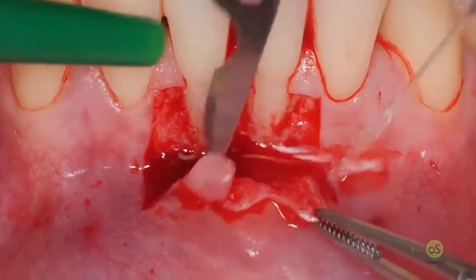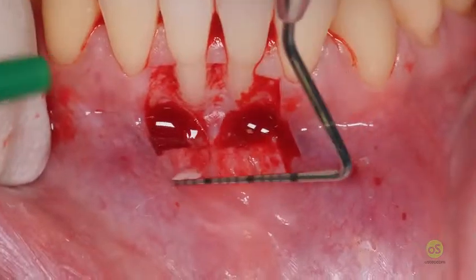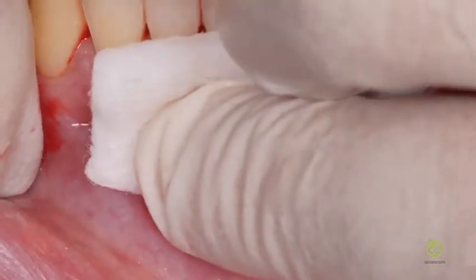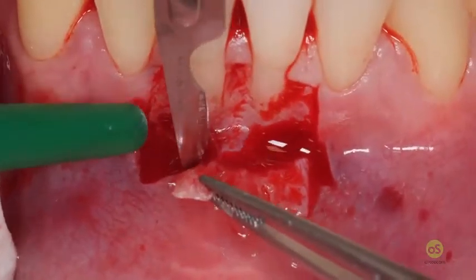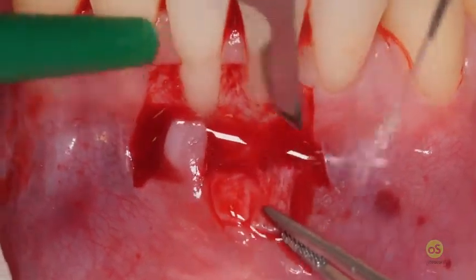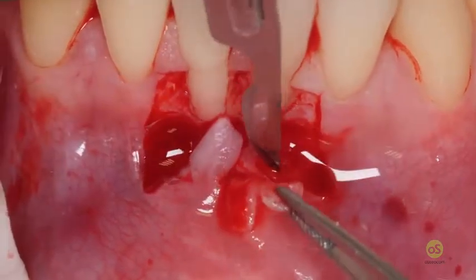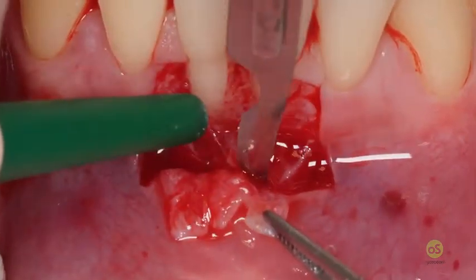Now you should see very well the muscles inserting perpendicular to the root. The flap is only made by 1, 2, 3 papilla. Now I have to create a flap by making this superficial incision. So I pull the lip, make the incision very superficial. I pull the papilla here. I make this incision parallel to the lip. Now the most difficult area is the area of the frenulum, between the two papilla. Here.